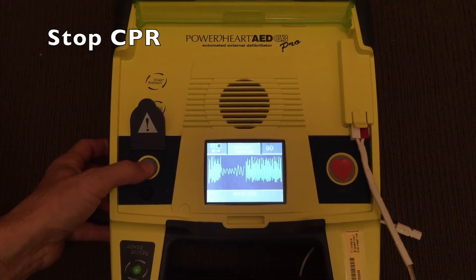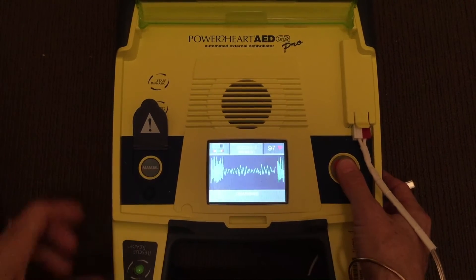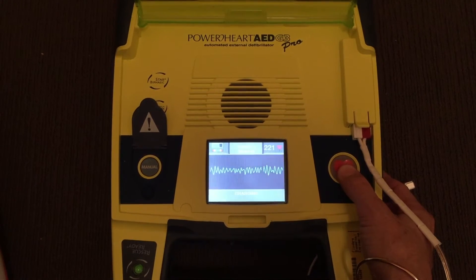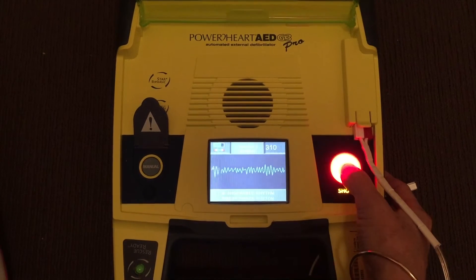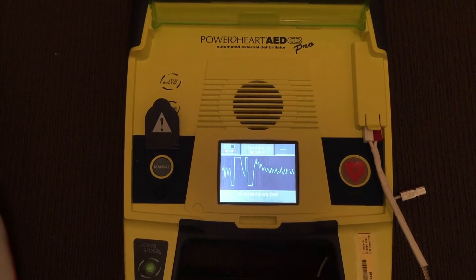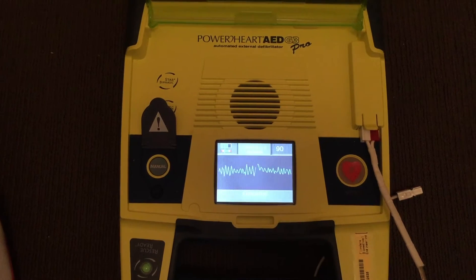Shockable rhythm. Entering manual mode. Oxygen away. Top, middle, bottom. Everyone clear. Stand clear. Shock delivered. Start CPR. Give 30 compressions, then give two breaths.